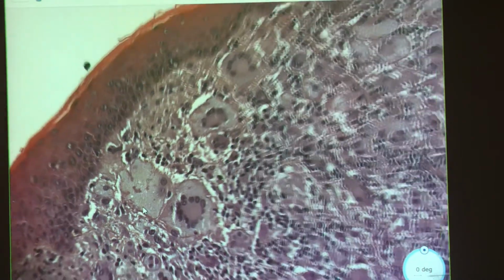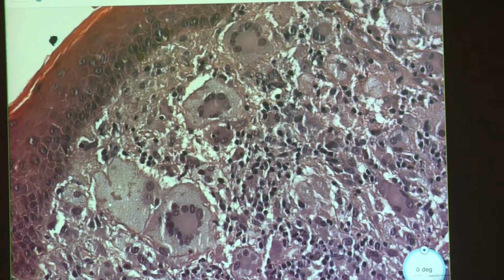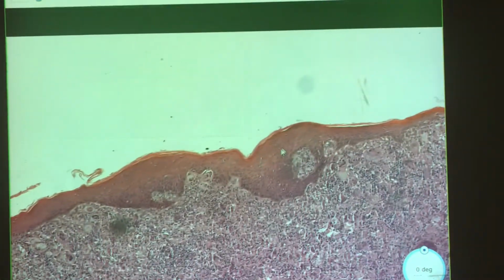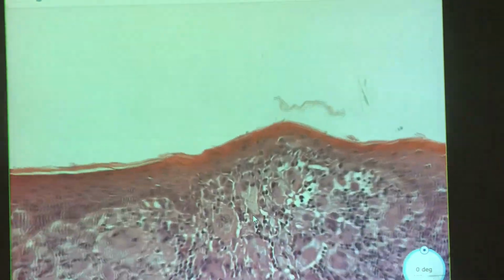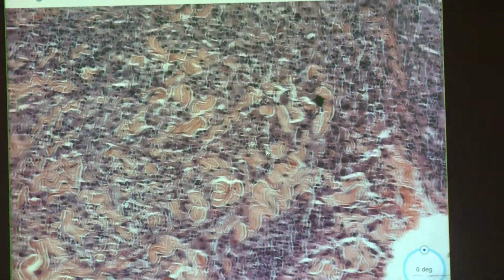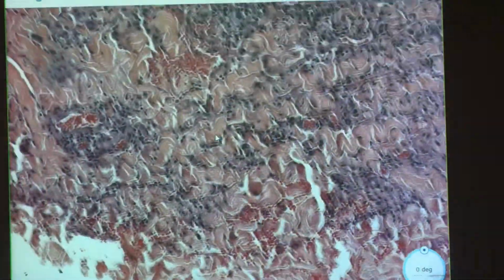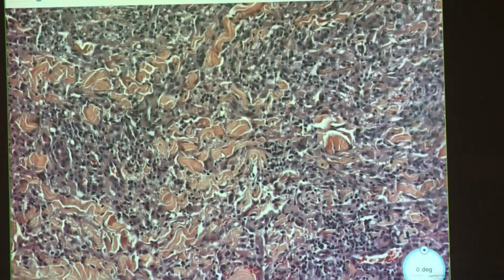They're huge. But there's something important about the giant cells. Where are you noticing them? Superficially. Do you see them anywhere else? Do you see them deep? Not really. You weren't looking for them before. Well, I wasn't really seeing much. Because I started looking down, I didn't know what I was looking at. There just seem to be cells that are not very distinct.